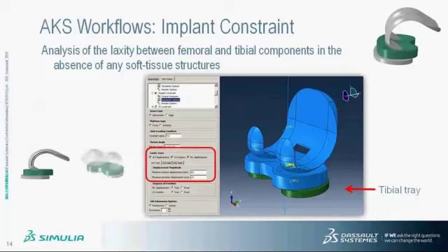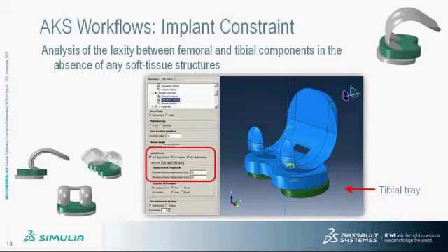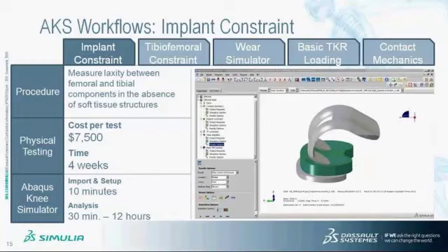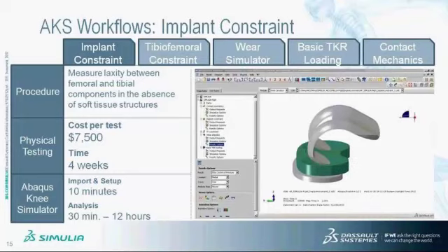A number of laxity tests are provided for this workflow that include the anterior-posterior displacement laxity test, the internal-external rotation test, and the medial-lateral displacement test, and for each laxity test, the load is applied as a boundary condition instead of a loading condition. For this workflow, the cost for performing a single laxity test is around $7,500 and takes roughly 4 weeks to perform one single test. As you can see, compared with the physical testing, running simulations saves a lot of time and also cost.